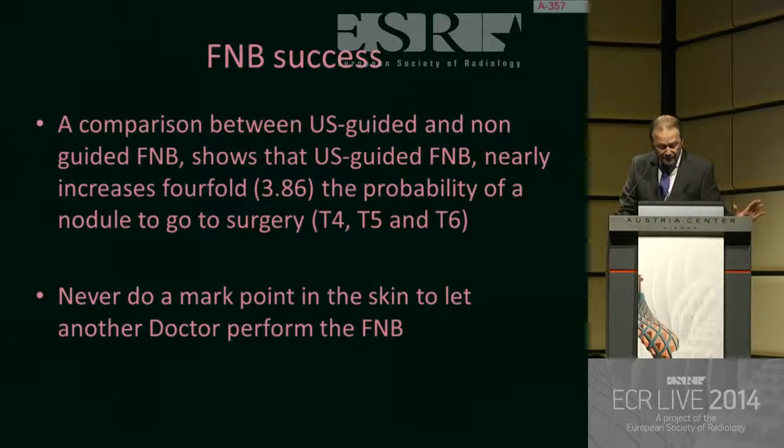In my institution I did a comparison between US-guided and non-guided FNB in almost 400 nodules done by the radiology department, by me, and another group of the same number of different nodules performed by pathologists without US guidance.